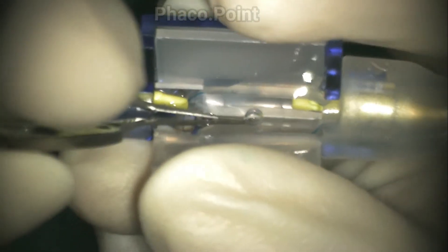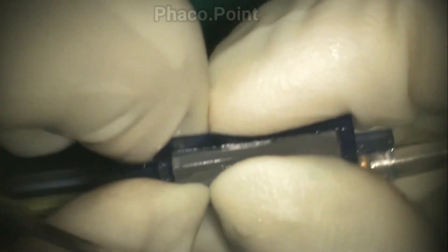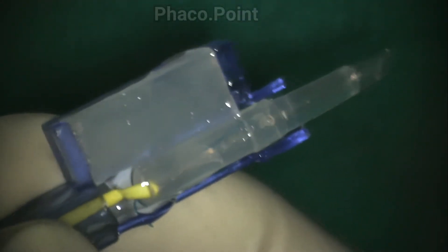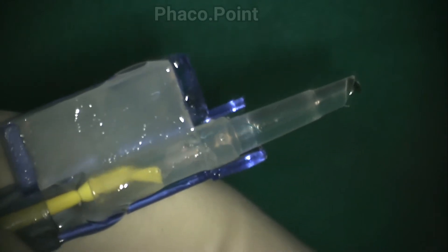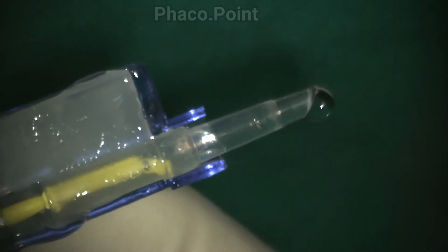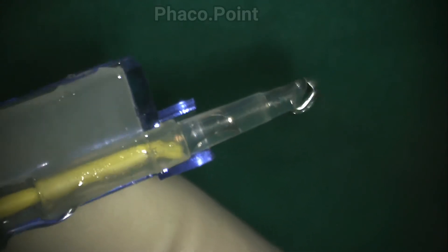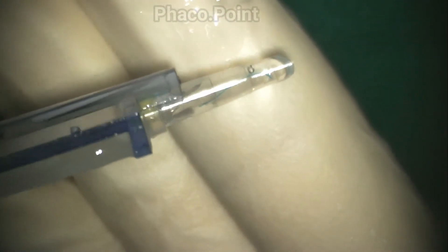The protective plastic cover over the lens is then removed. The surgeon uses McPherson's forceps and confirms that the IOL is properly sitting within the cartridge. The protective cover over the tip is removed and the cartridge is then snapped shut. Under direct visualization under the light of the microscope, one then slowly pushes the IOL anteriorly.